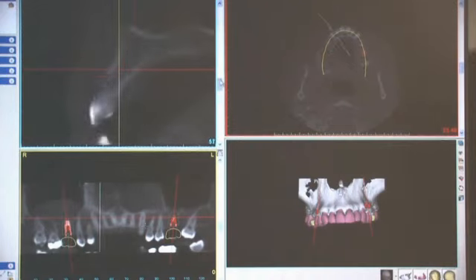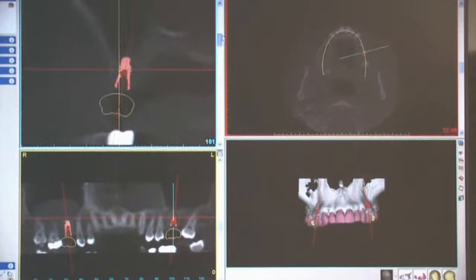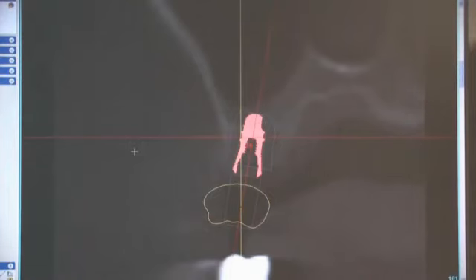What's nice about the Cybron system, too, is having the neck 4.8 millimeters in diameter, and it tapers down to a 4.1 body. Again, I know that we have a definite stop. We're not going to be able to push that implant into the sinus if, for whatever reason, we made an error. Having that wide diameter neck really is an advantage in the posterior maxilla.